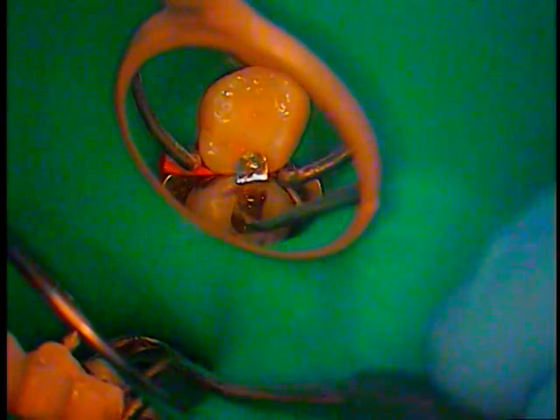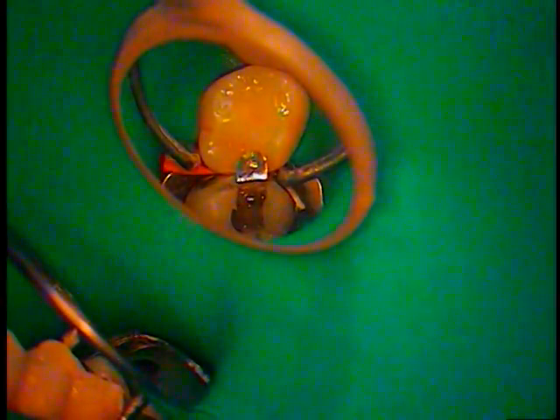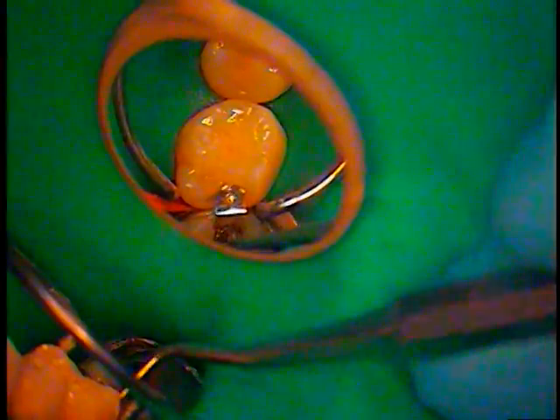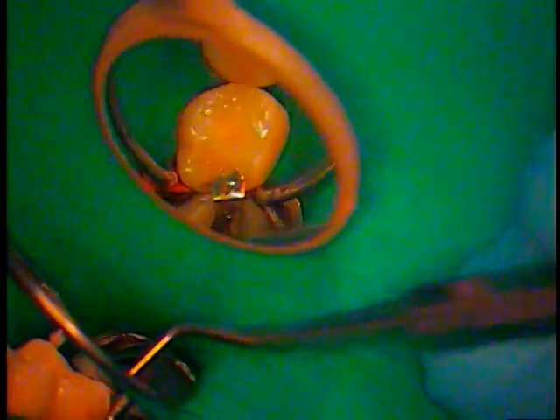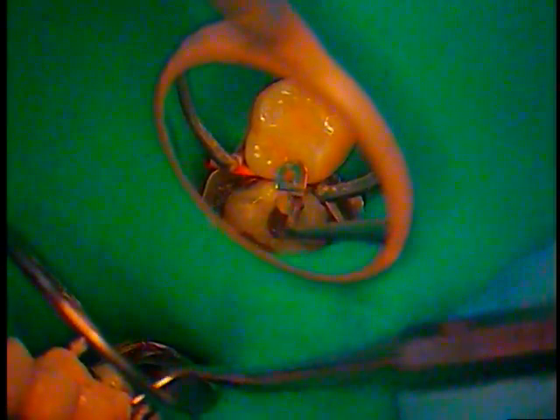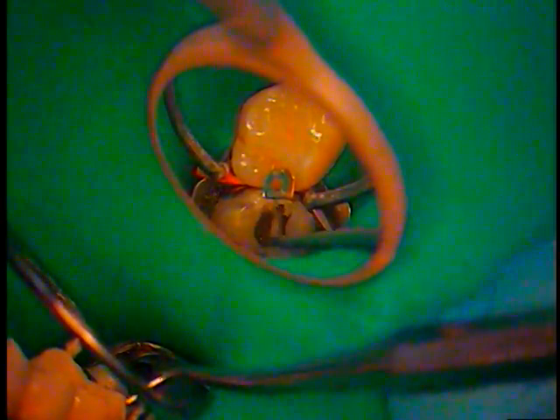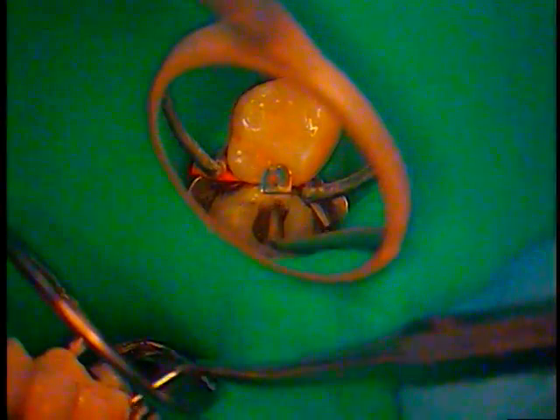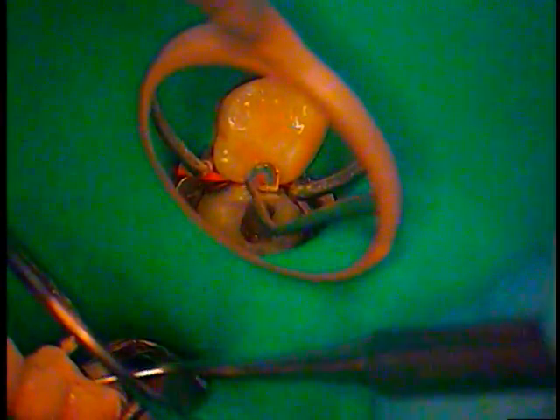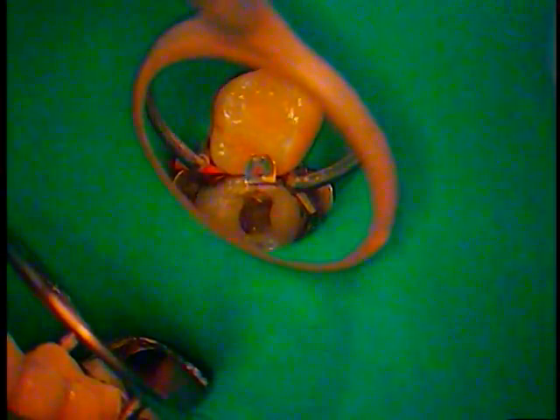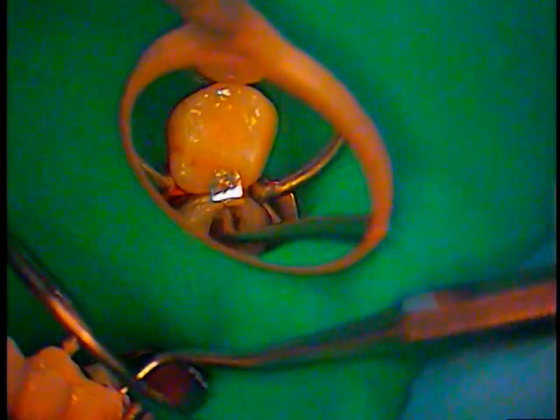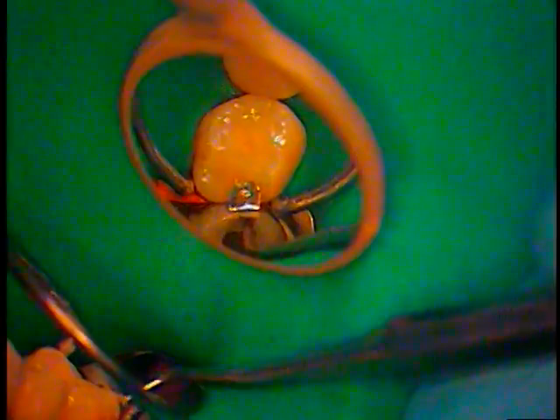I'm going to have you place it and I'll condense it. You see how this fluid portion's coming up? Get rid of that. Wipe. Do the same thing on the other side now.